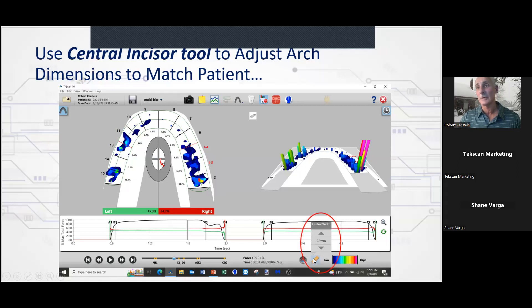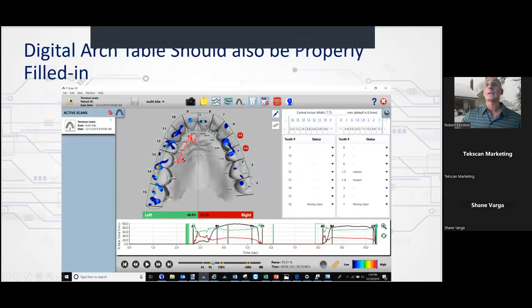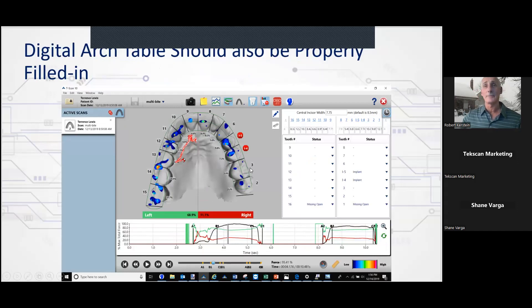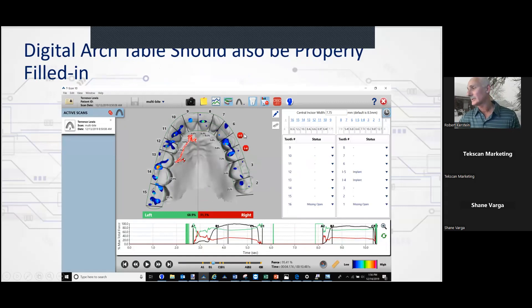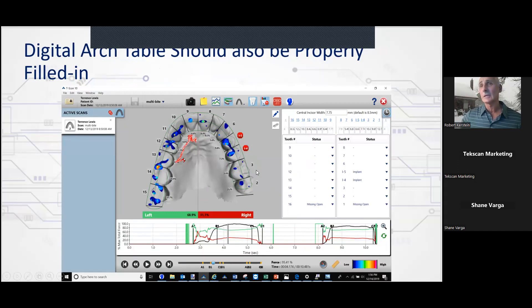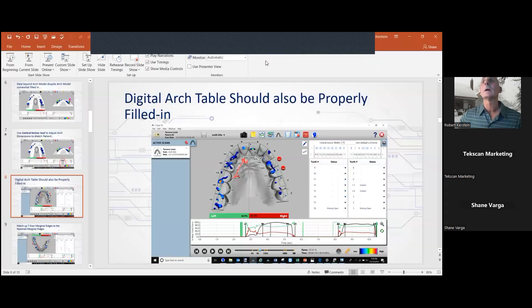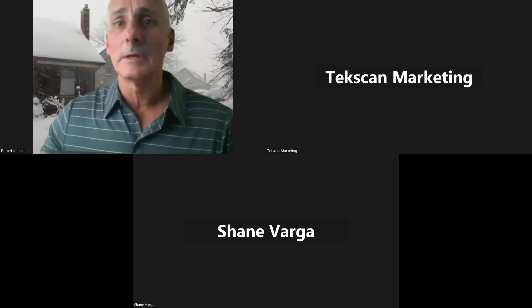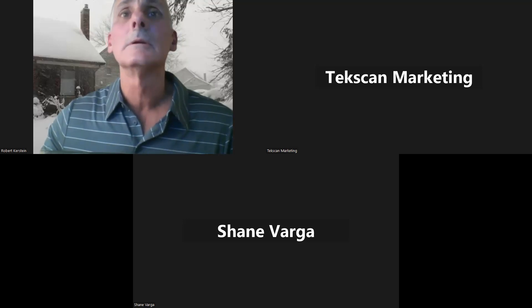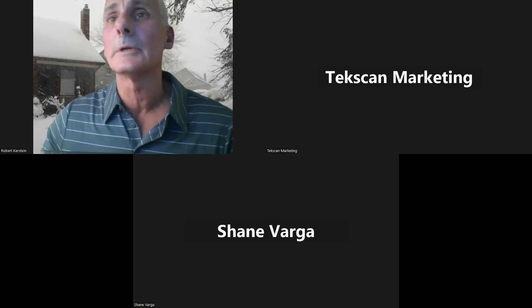The same things apply to the digital arch. You may have a very nice digital arch, but if you don't line up the marginal ridges or label the implants, you won't get an implant warning. I'm going to show you a digital arch that's very unique and will help you use some of the other tools. Let me leave the PowerPoint and go into my T-scan to show you.